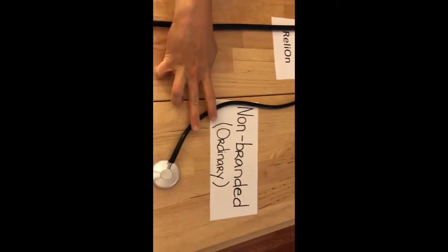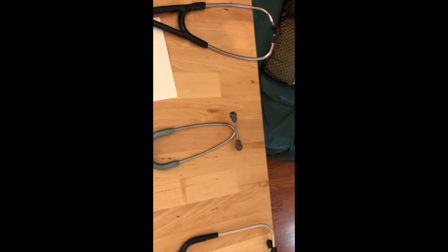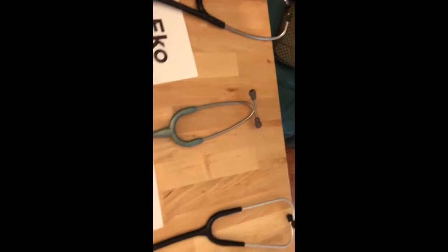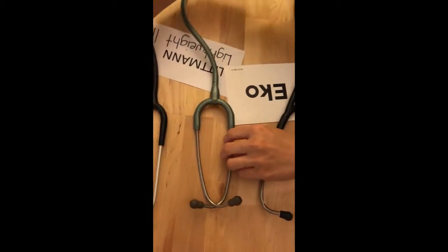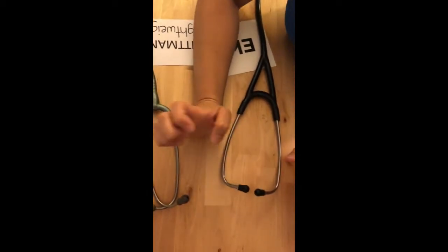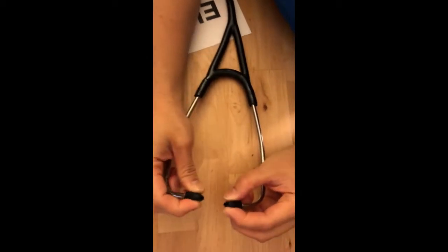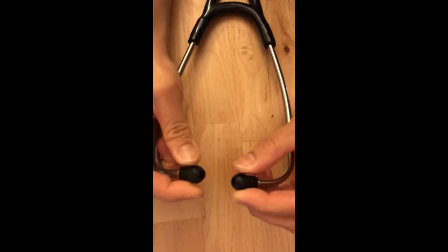I'll go through each detail from top to bottom, just like how I did with my Echo review, so you will know which is a good fit for you. Let's start with the ear tips. For the Echo Core, this is soft and squishy — I like it.